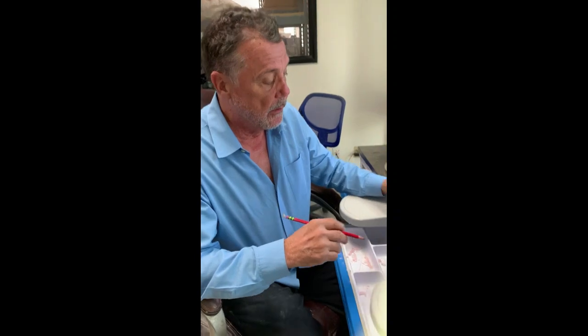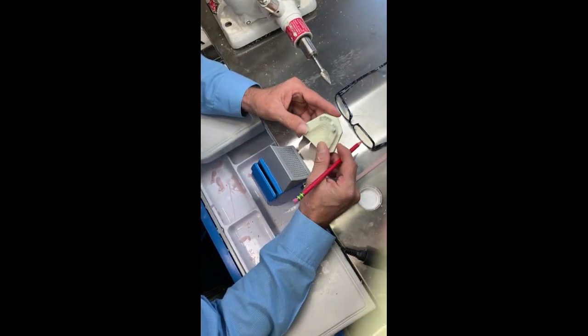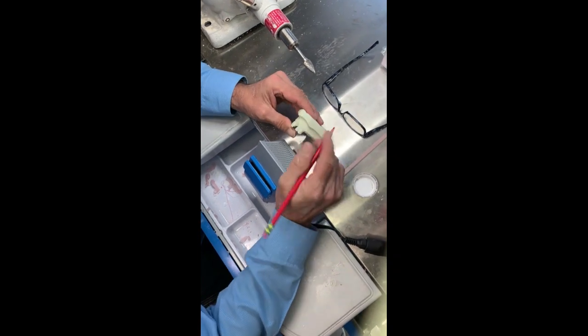Our new Elastic Grip stay plates. The acrylic comes in clear, pink, and Meharry. Right now I'm going to demonstrate how to do a 1-2 stay plate. Go ahead and get your master model. It's not necessary to make a duplicate, and you'll see why in a minute.